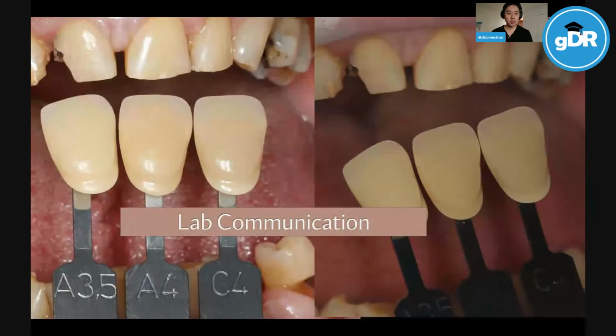Another reason to do photography: lab communication. You can use polarizers to remove a lot of that flash from the light and give yourself a more accurate shade taking, especially anterior, like veneer cases or anterior crown cases. Your lab has a better chance of nailing the color there.